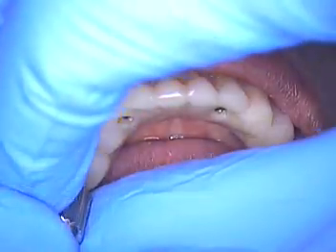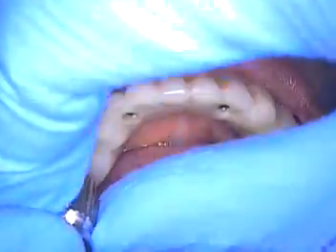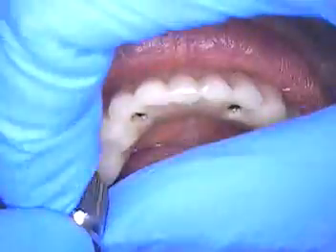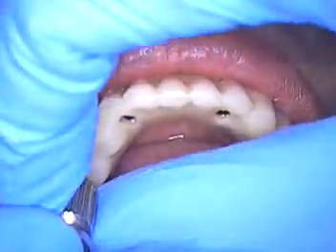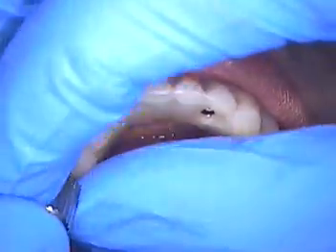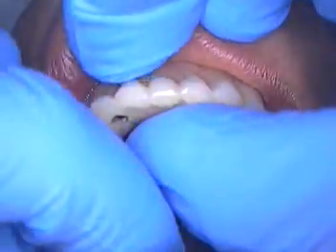If we did everything according to plan, everything should just more or less drop in today. We do have to do a little bite adjustment for our patient, so we're going to pick this up in a little bit with the try-in itself. So let me just go off view here. I'm just going to follow this over to the right, and we'll follow that right over.